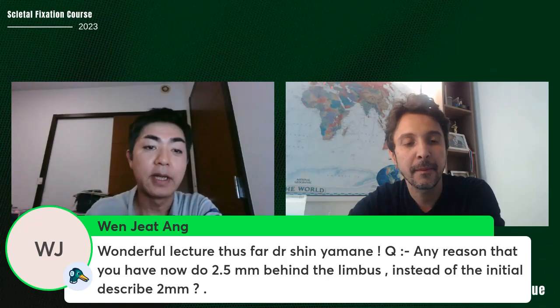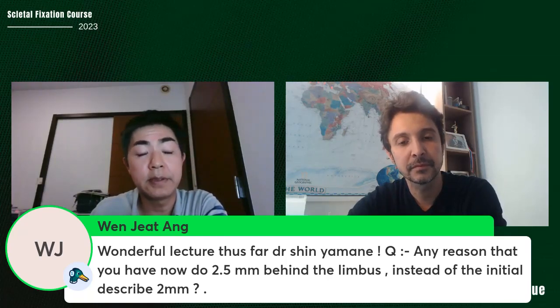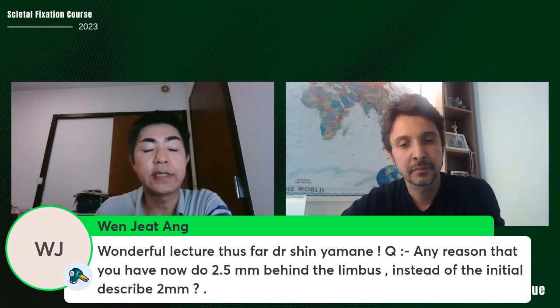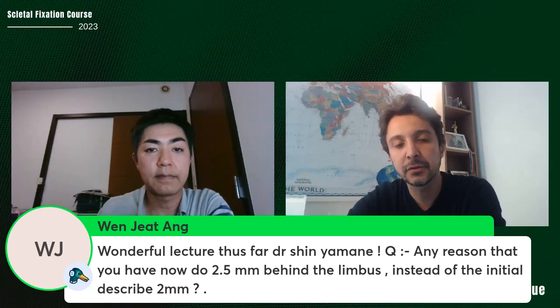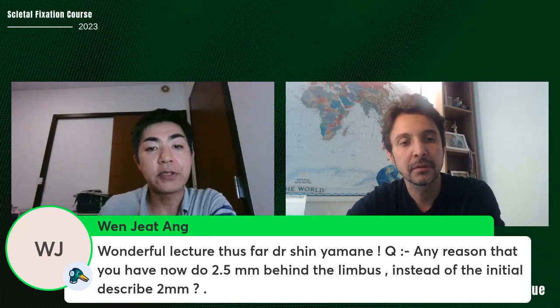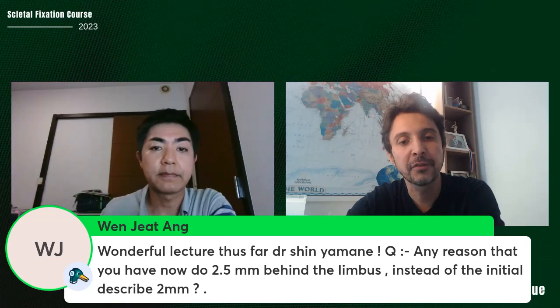The distance from the limbus. Yes, I first make the scleral tunnels 2 millimeters from the limbus, but I had some cases of optic capture, iris capture after surgery, so I changed to 2.5 millimeters. So when you change to 2.5, you don't have more capture? You solved this problem? Yeah, unfortunately I still had some cases of optic or iris capture, but it decreased. Well, 2.5 is better, right? I think so. Yeah. Great.